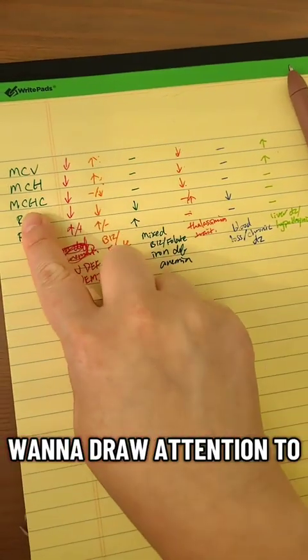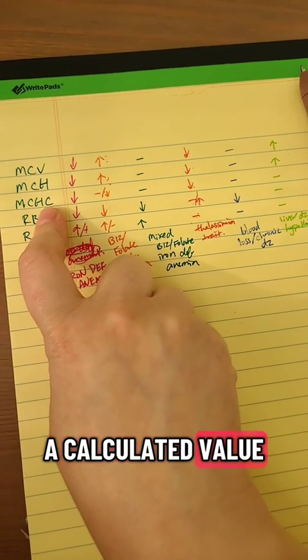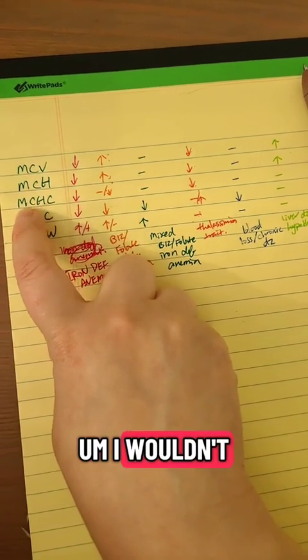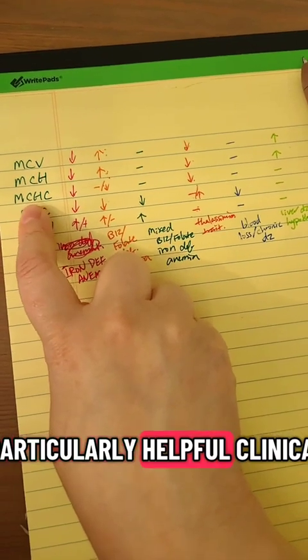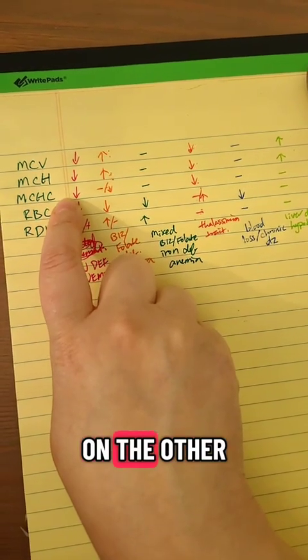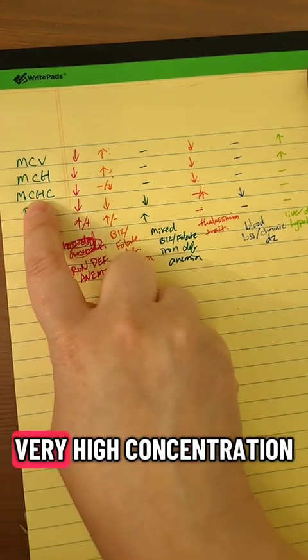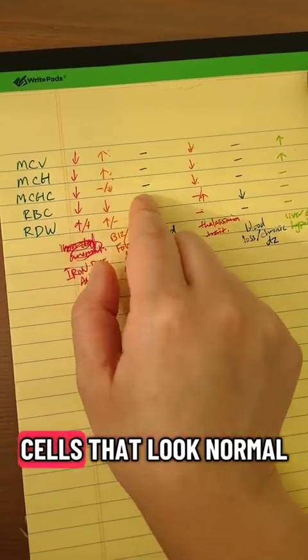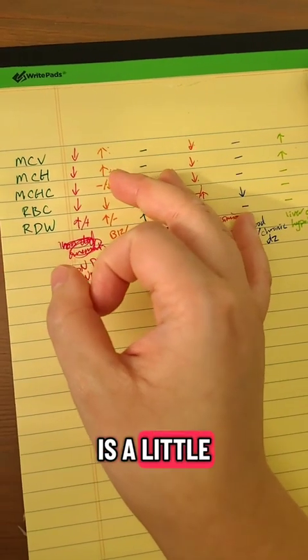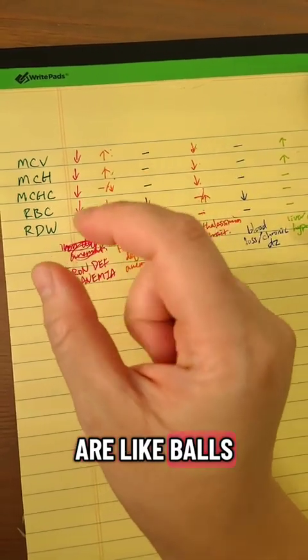One thing that I want to draw attention to is the mean corpuscular hemoglobin concentration, because this is a calculated value in the lab. So sometimes this one can look low all by itself. I wouldn't consider that to be particularly helpful clinically if this one is just low all by itself. If it's high, on the other hand, we might want to look into a blood smear as well, because if there's a very high concentration of hemoglobin in cells that look normal otherwise, this could be an indication that the cell shape is a little bit weird, like in the case of spherocytosis, where the red blood cells are like balls instead of donuts.